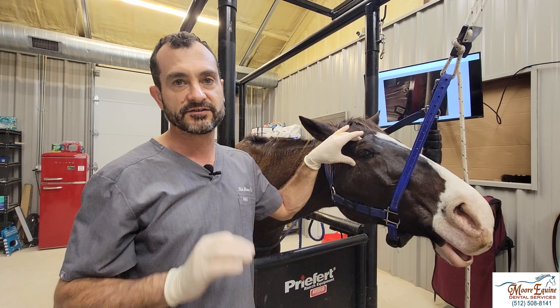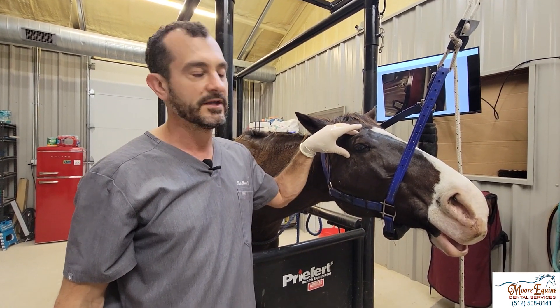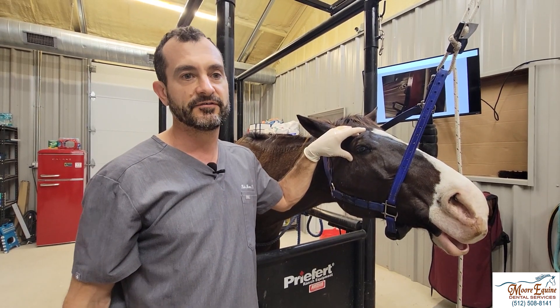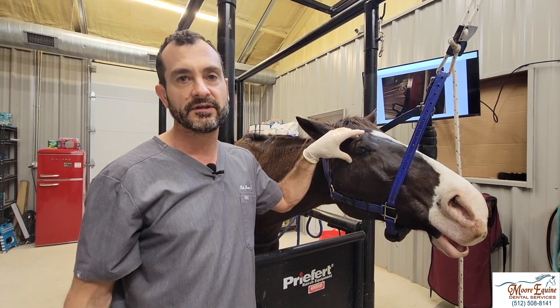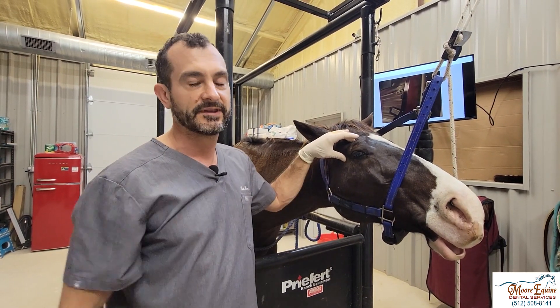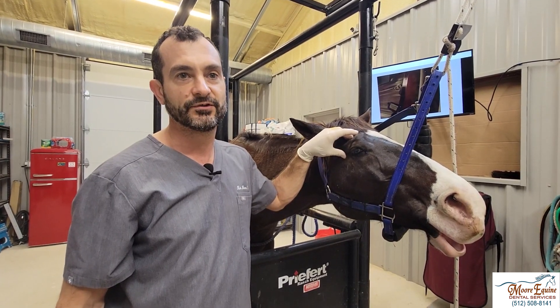That's how to do the maxillary nerve block. It's a very safe, very effective, excellent block. Don't be scared to do it, and you don't have to buy expensive or hard-to-come-by blunt needles or anything of that nature. I've done thousands and thousands and not had any problems with it. Good luck.